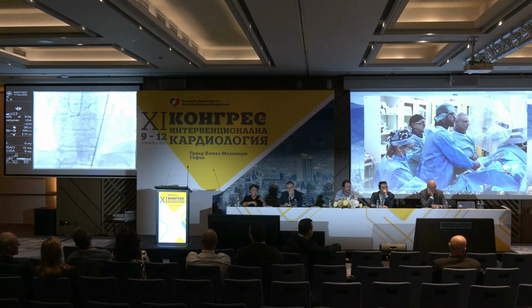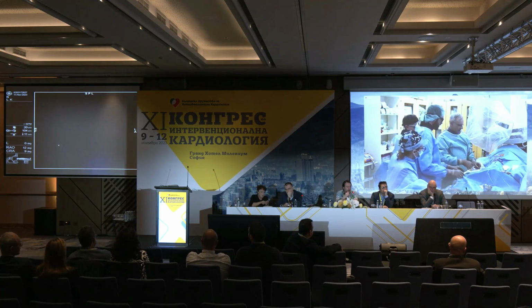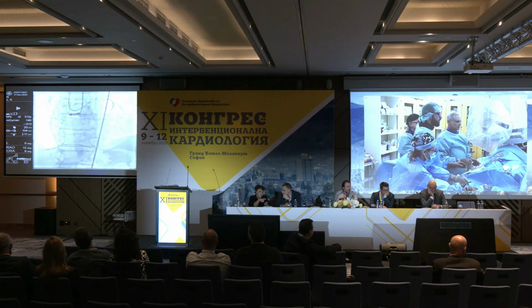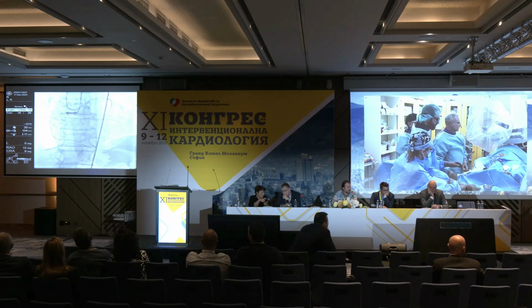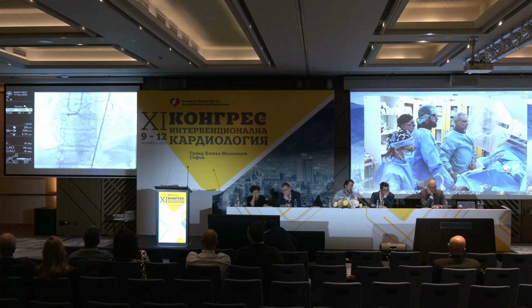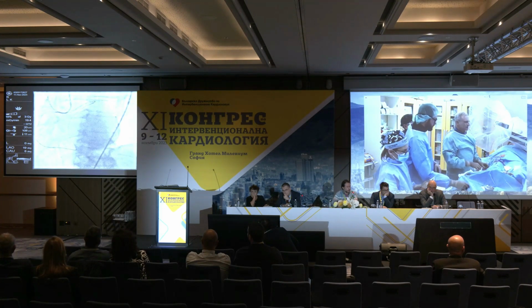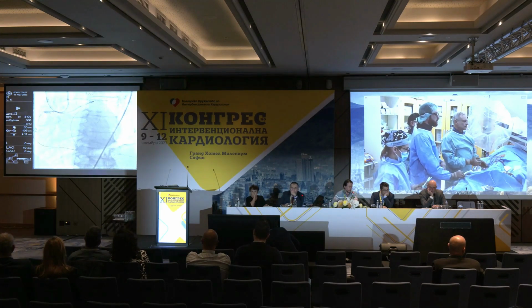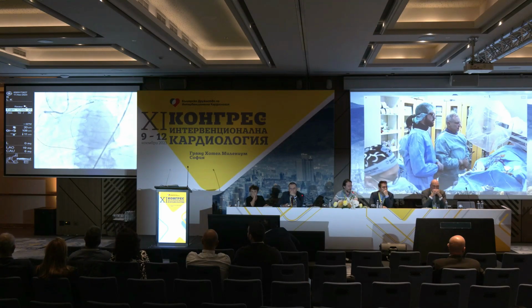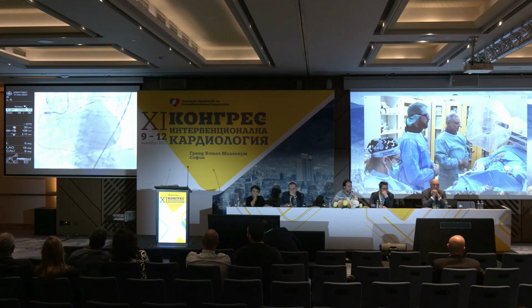So he is struggling there, and there is a good teaching point here: how he will puncture antegradely, what maneuvers he will do, what techniques, what kind of moving-the-cap techniques he will use here. I think this part is very interesting, at least for me. I don't want to rush into more complex techniques of this kind until I exhaust my options. Yeah.